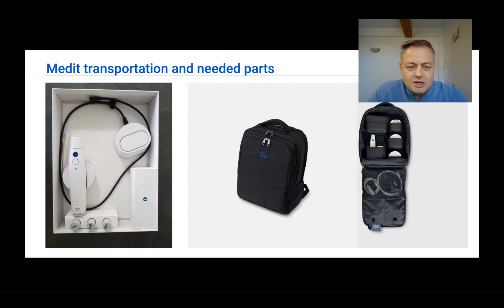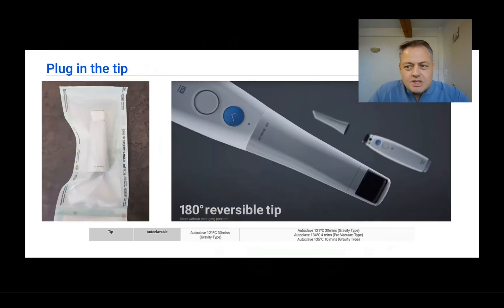When transporting the scanner between operatories, I use the lid from the box and place everything inside because I don't want to drop anything. It's good to transport the scanner and cording parts in some enclosed compartment between spaces so that you don't drop or hit them.